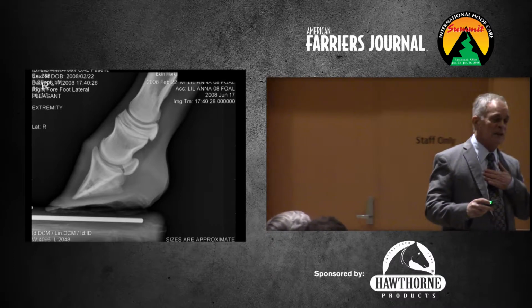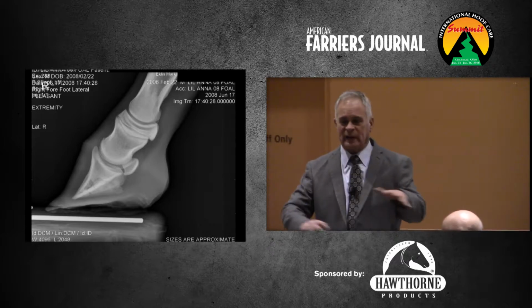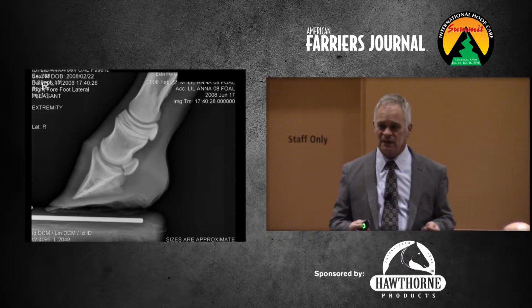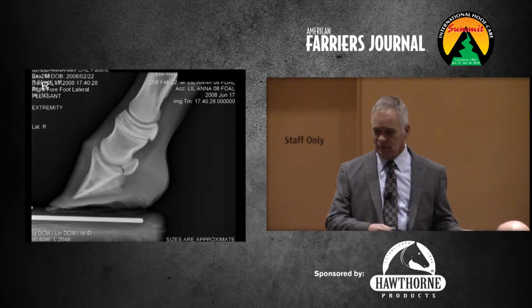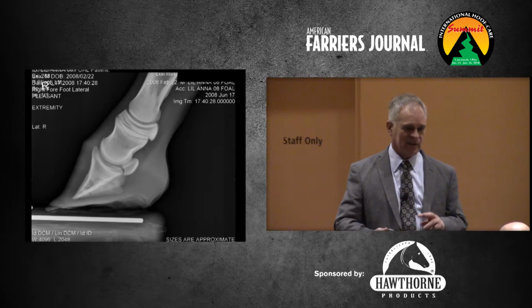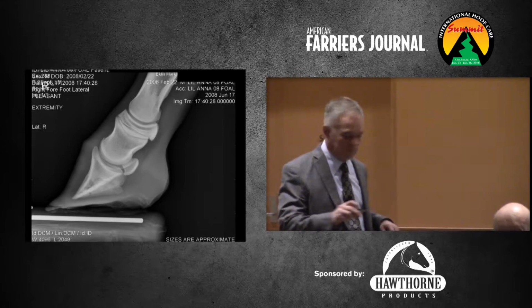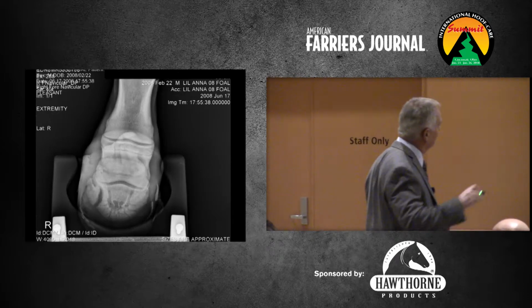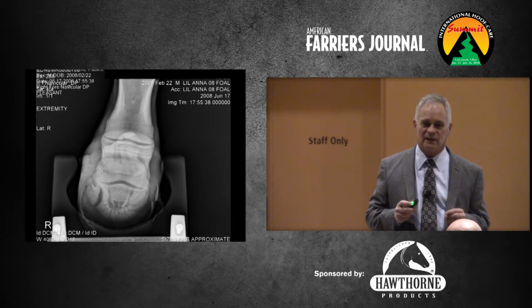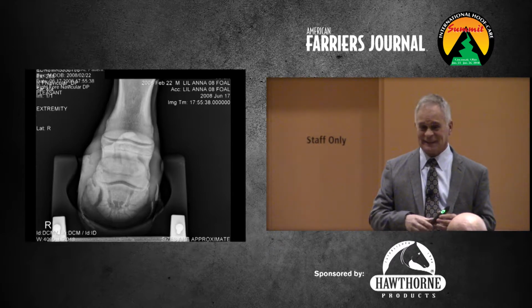In this one, I'll just say it, lesson learned from me. I was with the student, and I was packing up everything now, and they're like, well, Dr. Pleasant, aren't you going to take the other views? And I'm like, what do you mean? I got what I need. And they're like, well, Dr. Moon, our radiologist, says you always got to take those views. I'm like, okay, if you want to take the other views, take them. So they took them, and this filly has a fractured P3. And I'm like, wow, okay. A lesson learned from me.